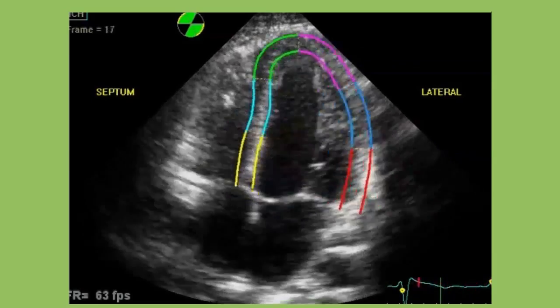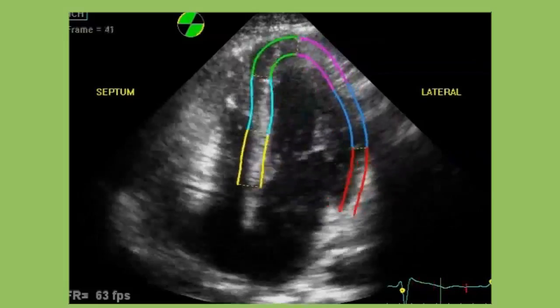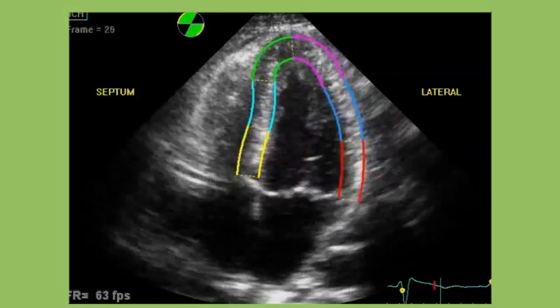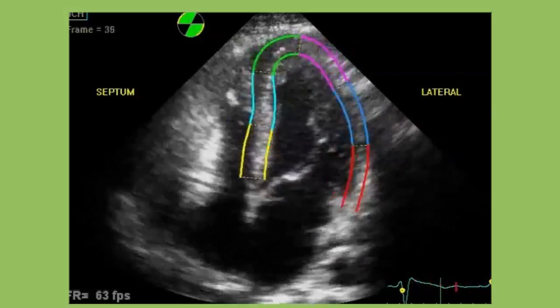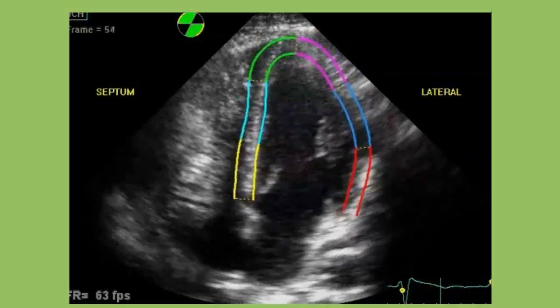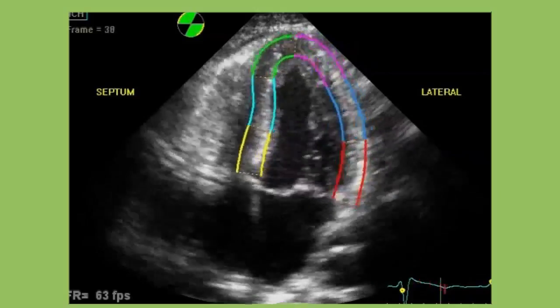So I'm coming back over here to the case that I showed you at the beginning of the presentation. I can assure you that I have shown this case all over the globe, over and over, and all of the audiences have agreed that in their own echo laboratories they would call that ejection fraction normal. So let's see how normal it is.